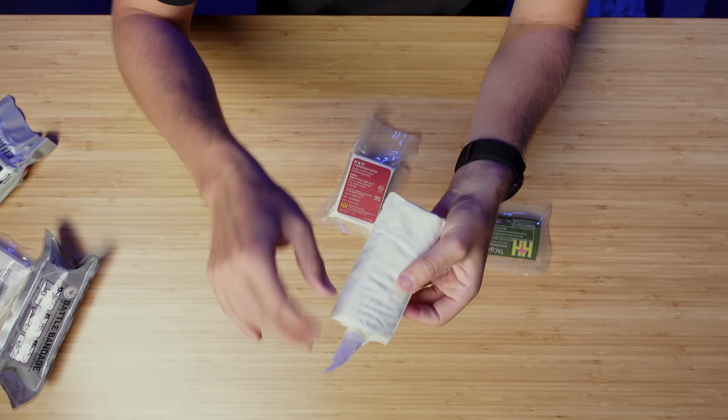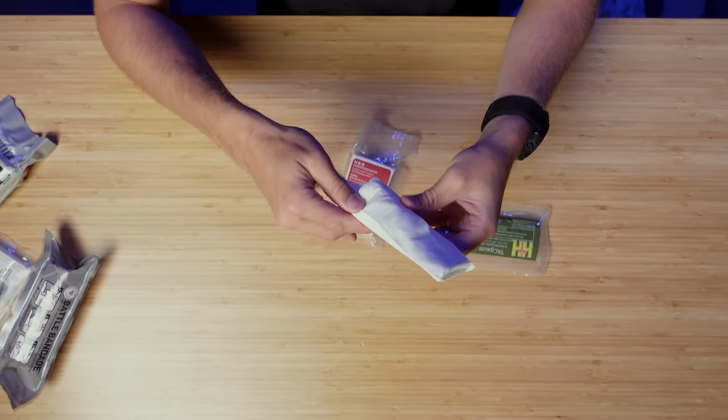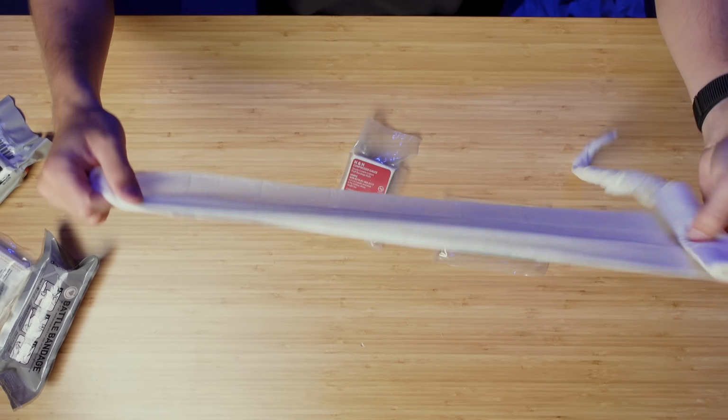So you have this tail, and all of them that I open have this tail, and you can use this to pack the gauze down into the wound if you want. But there's also an end to it right here that you can pull out, and you can pack in this way or use this as just a bandage.